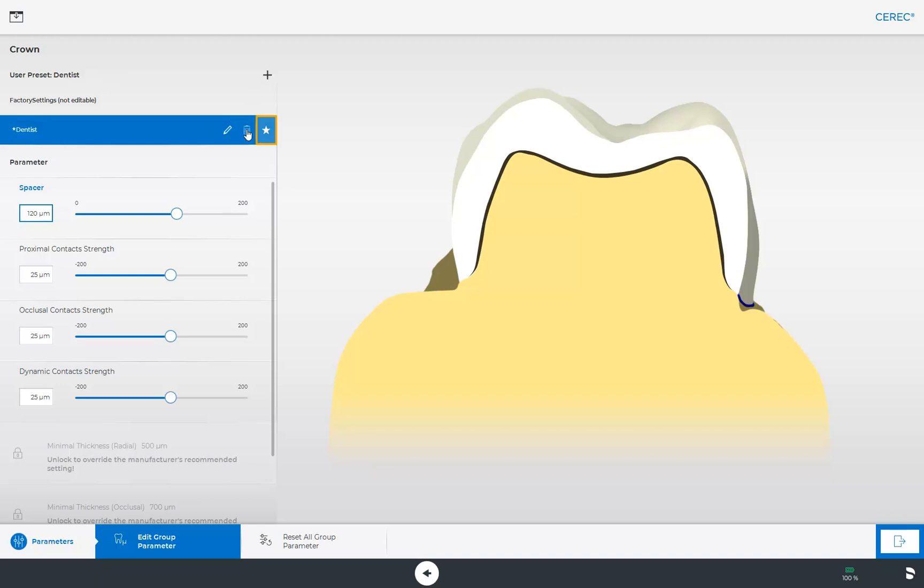You can mark the newly created profile as your favorite by clicking the asterisk icon, or you can delete it again by clicking the waste bin icon.